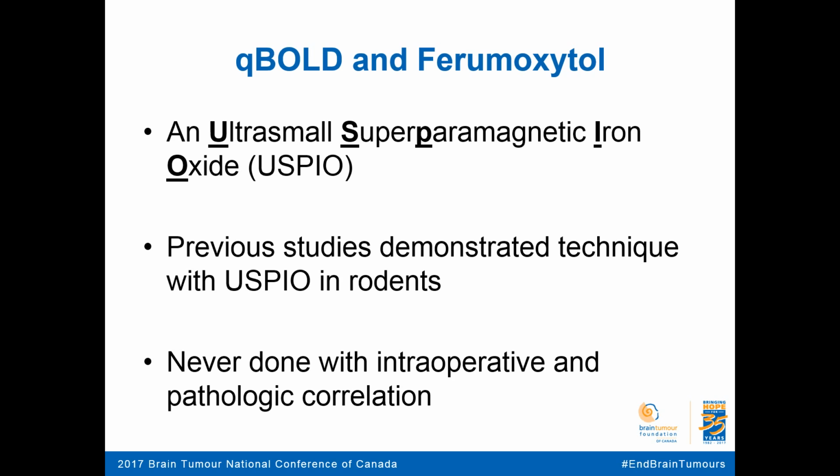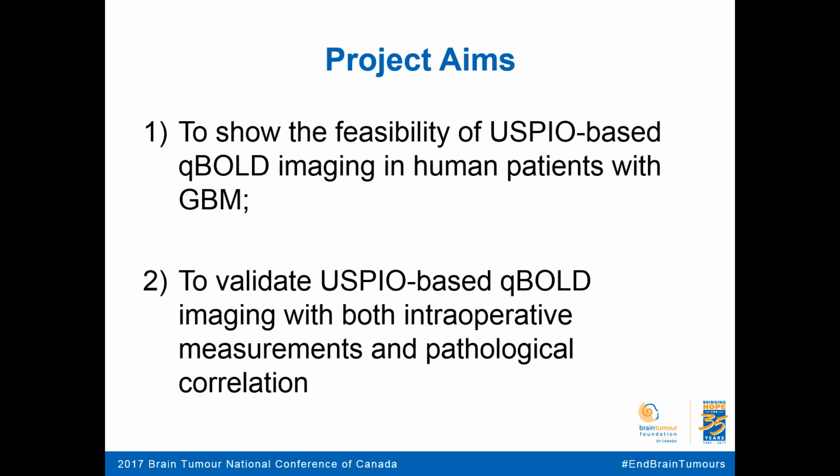So what we wanted to do was see, one, if it's possible in humans, and second of all, we wanted to validate it. How are we going to validate it? That was the hardest part of my project. So I proved that I can do this study, I can come up with these maps, so I needed a surgeon willing to help me set up my equipment in the OR to put oxygen probes into parts of the tumor intraoperatively. And actually most of our cases that we've done, Dr. Das, who's sitting here, was the surgeon.